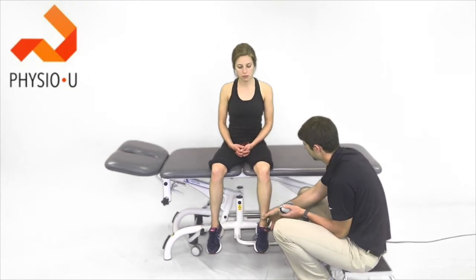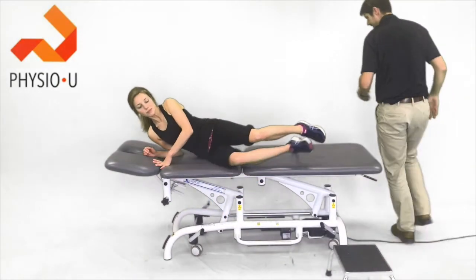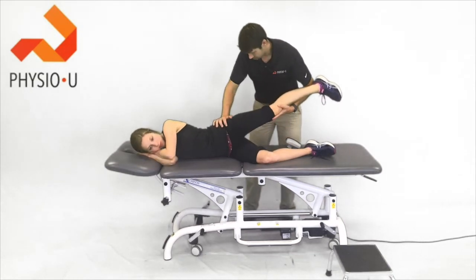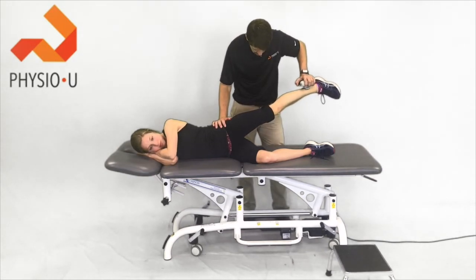We can also look at the glute med. Have the patient lay on their right side. Bring their leg up and hold there — hold strong — at about 15 degrees of abduction. Then go ahead and push up into the hand.